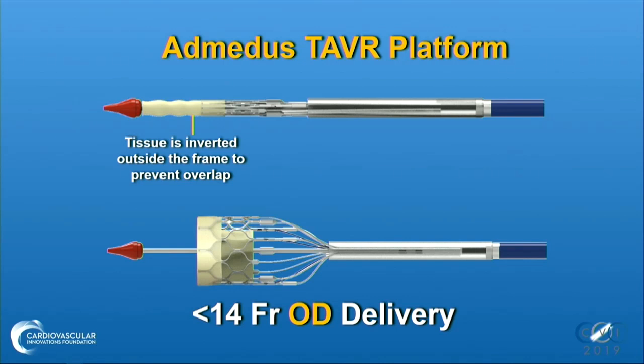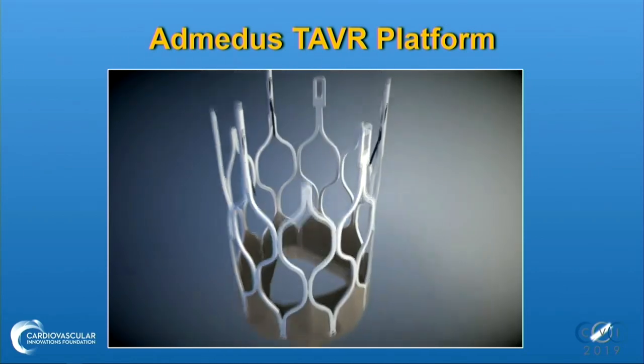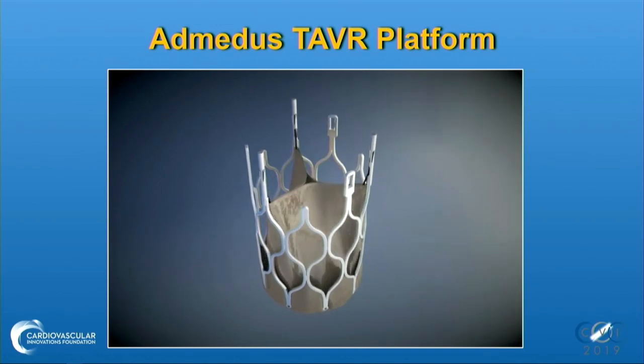And you can see this is the way it's done, is that the tissue, because it's so controllable in terms of the thickness and its malleability, it can actually be implanted in an inverted position. So the single-piece valve is put in inverted on the frame, and then it's actually inverted as it's inserted into the patient. And what that does, it allows TAVR with a 14 French OD. So remember, that's OD. So if we're talking ID, that's as low as 10 or 11 French, or maybe even single digits. And so it's a very exciting platform that we're going to be seeing going into humans in the next year or so. And this is a video of how it's done. And hopefully at this conference next year, we'll be able to describe this technology for you in humans. So thank you very much.